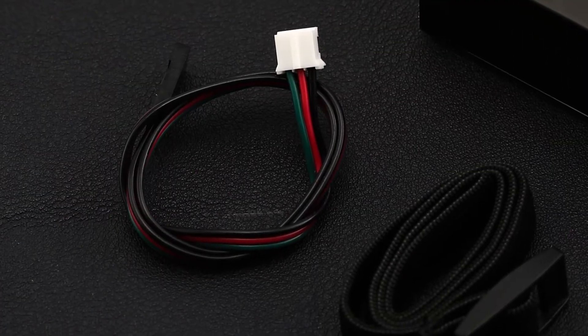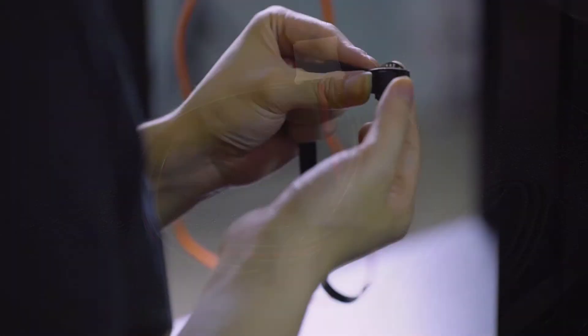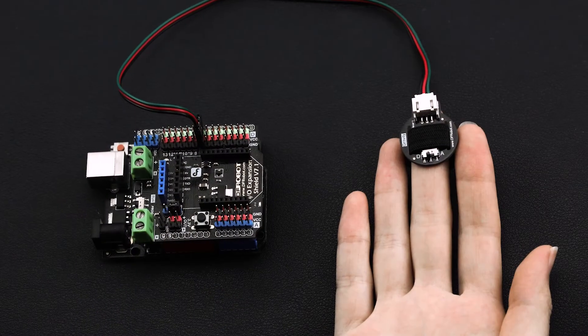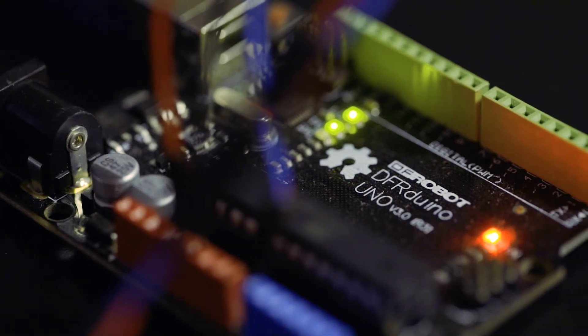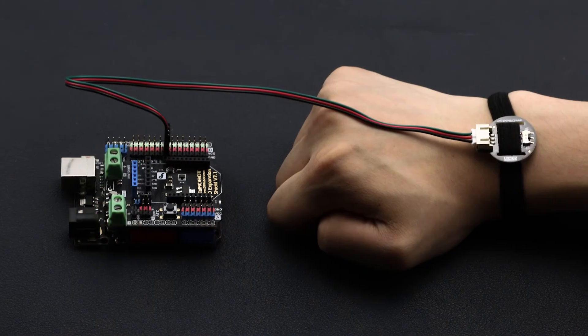To start, just attach the sensor to our body and hook up with an Arduino board. Before moving into setup, let's first take a look at the optical heart rate sensor and how it works.